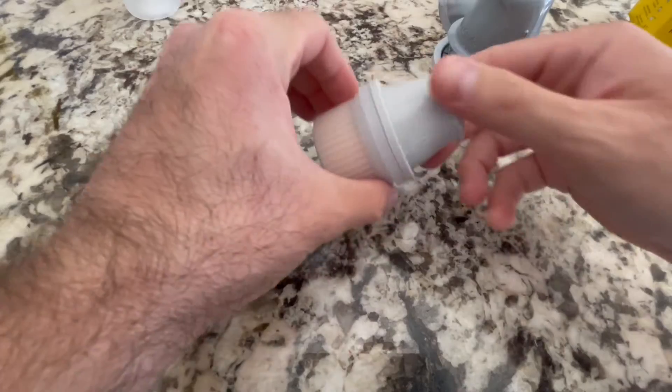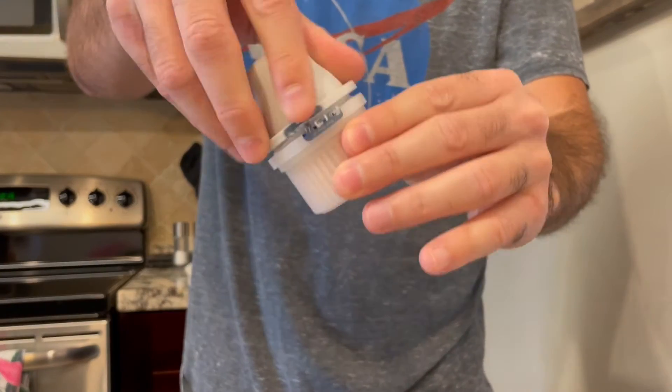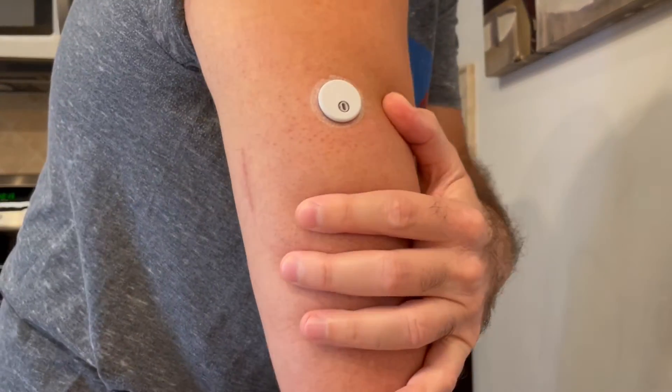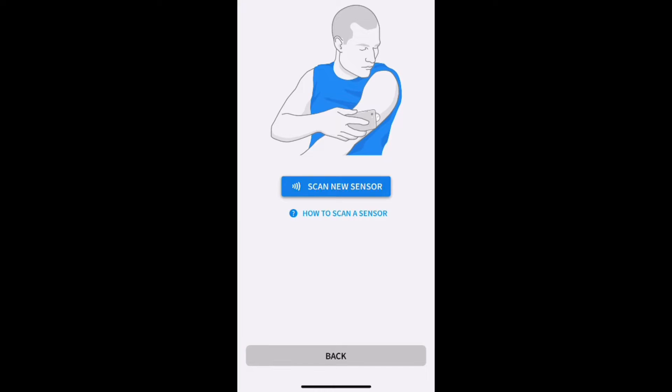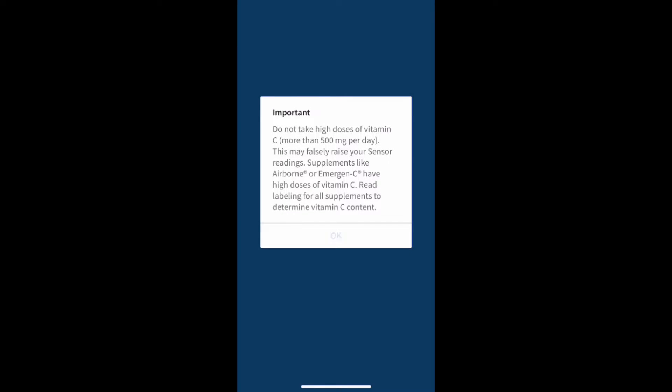Now let's talk about the application process. I've used the Freestyle Libre 2, the Freestyle Libre 14-day, and the Dexcom — and this was by far the easiest CGM I've ever put on. You literally pull out one part, unscrew it, clean your arm, push it on and you're done. Once it's on your arm, the only thing you have to do to link it to the app is scan it once. No need to put in codes or anything like that — just touch it to the sensor and it's linked.